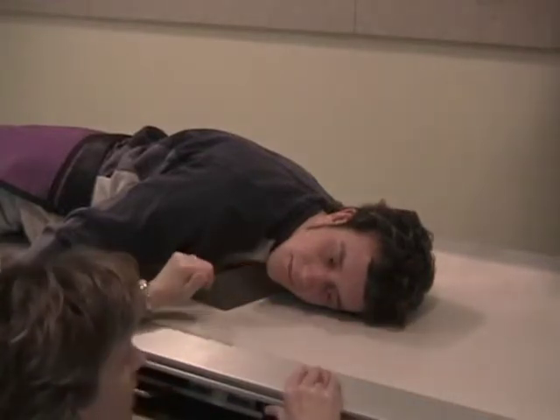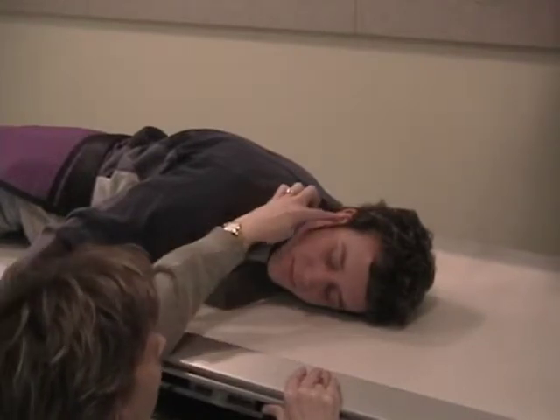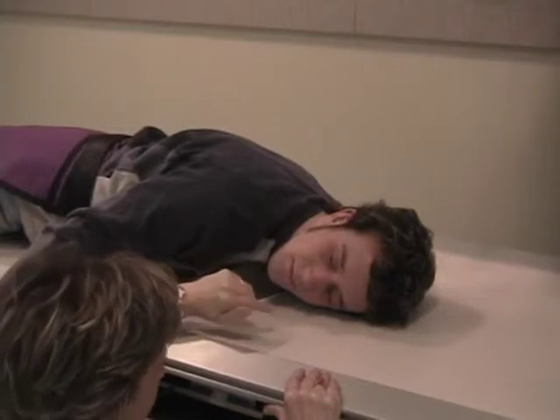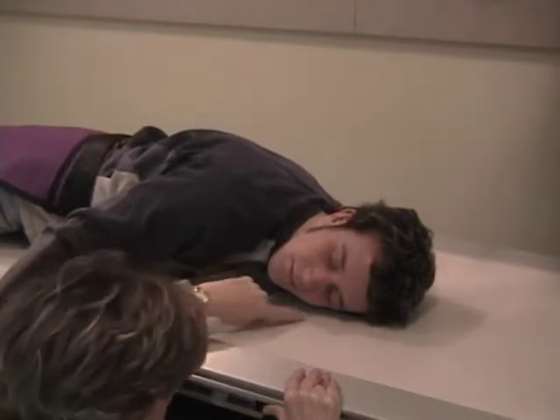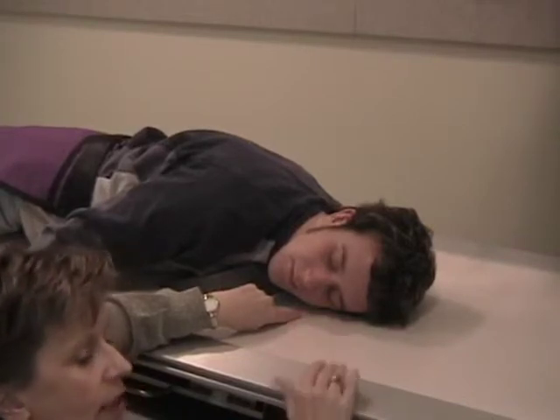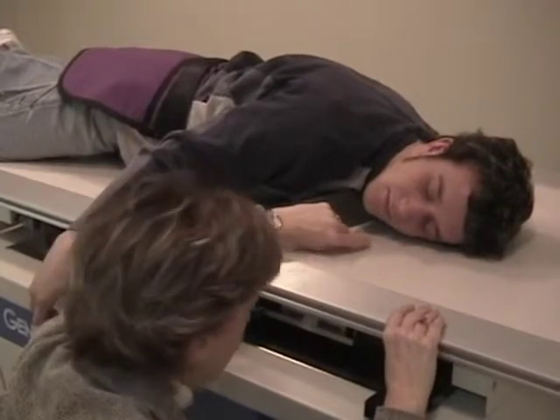And the MSP is parallel. Now, the TMJs are just in front of the ear. And the TMJ of focus today is his left here. Now, I have to do both. You know, the lesson's not going to show you both because he would be facing away from the camera. So I'm only going to demonstrate the left side.